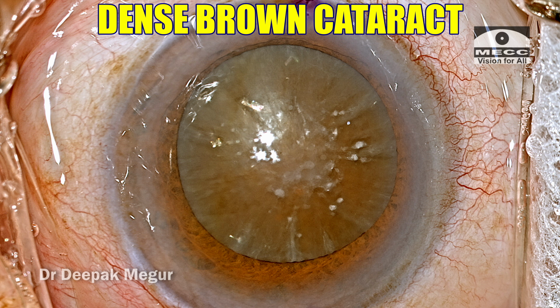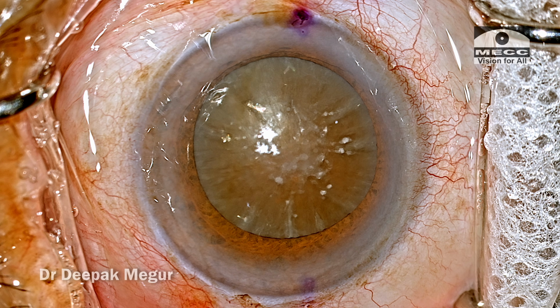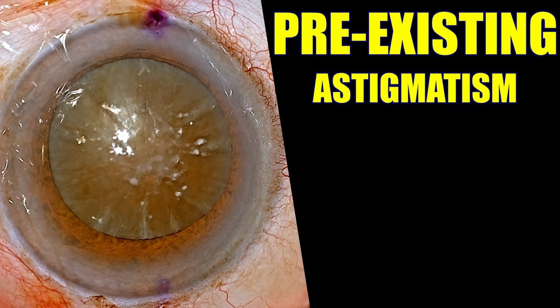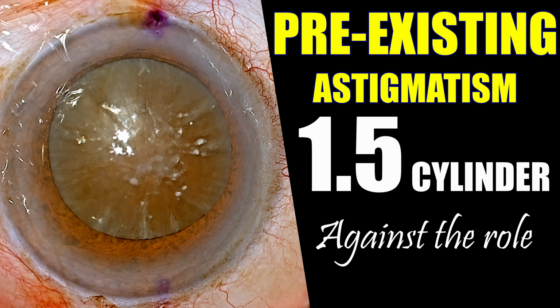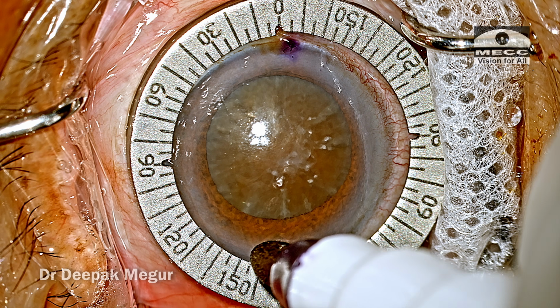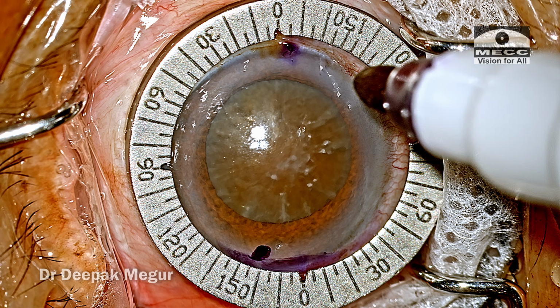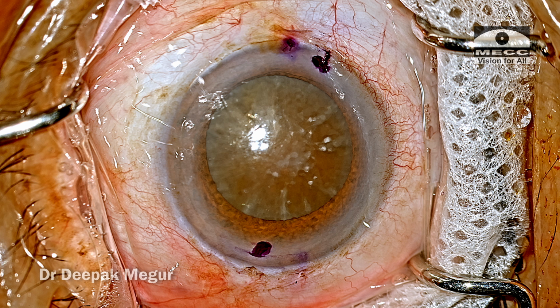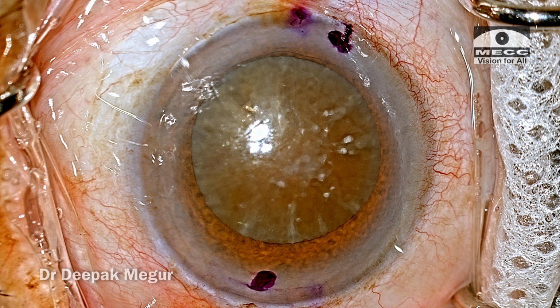It looks to be brown, and the point to consider is phaco versus SICS. She has a pre-existing astigmatism of 1.5 cylinder against the rule. And in our center, usually we put in a toric lens for every patient who is having 0.5 or above against the rule astigmatism, and this patient definitely fit in that category. And we have already got the toric lens in place.